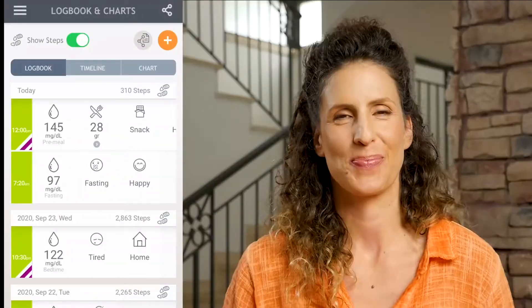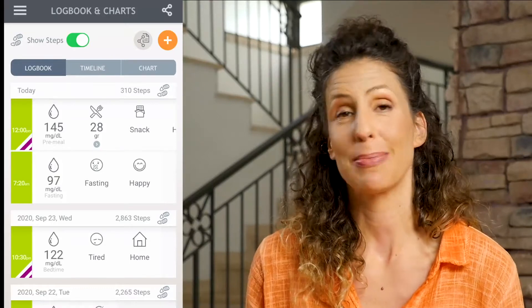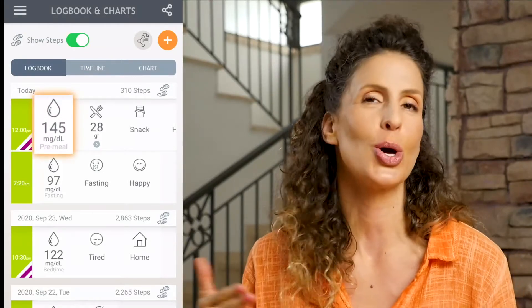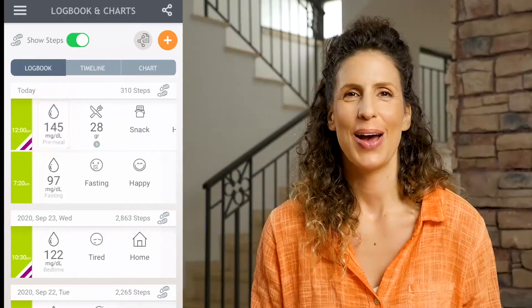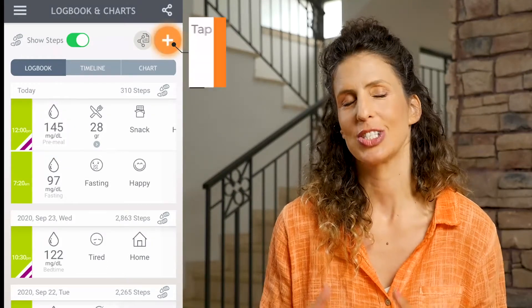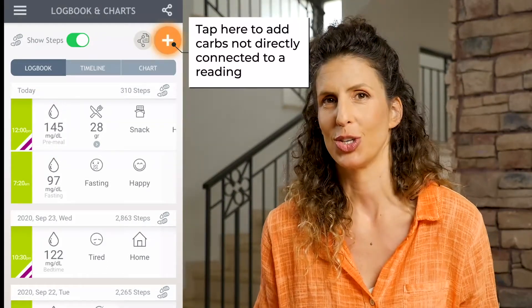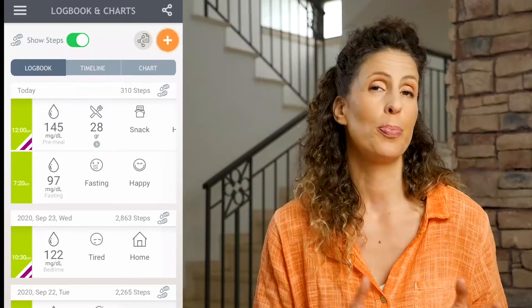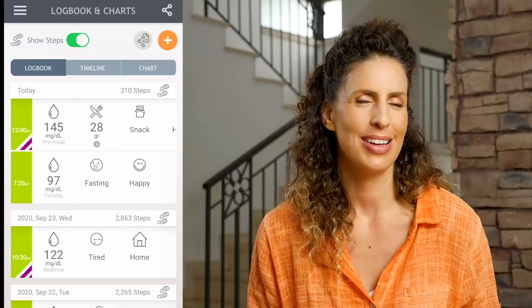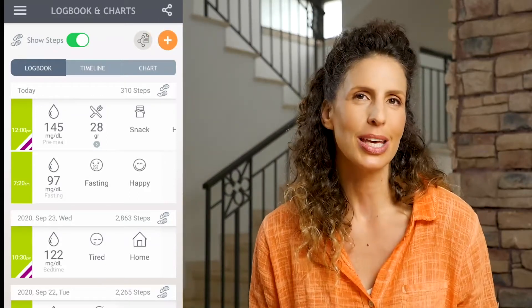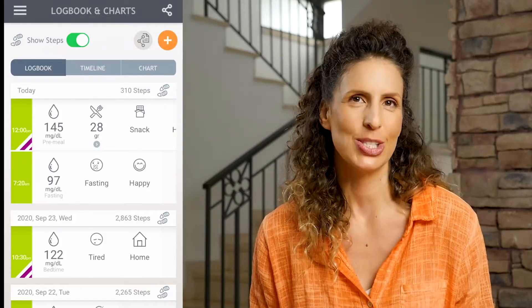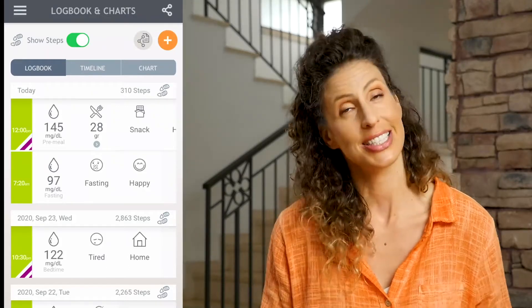When you finish tracking your meal, head back to the data entry page and press on the check mark to save. Here in the logbook you can see my pre-meal blood sugar along with the total carbs of my meal. Whether you choose to track your carbs connected to a pre-meal reading, on a data entry page not connected to a reading, or connected to a post-meal reading is up to you. The important thing is to pick one way and stick to it to make your logbook easy to read.